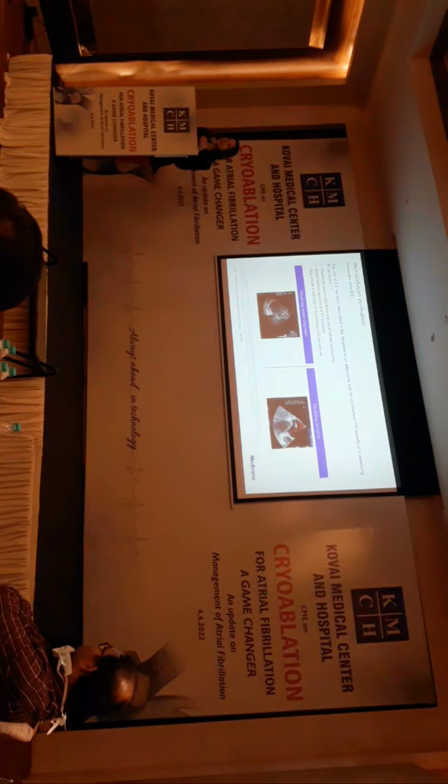The great news is technology is available. These images are for intracardiac echo, which currently this lab does not have. It's not essential. I certainly learned and did my ablations without intracardiac echo for a long time. Because the lab I work in now has it, I do use it. But today we did all the cases, had left atrial pressure to prove occlusion, and everything went very smoothly without having that extra bit of information.